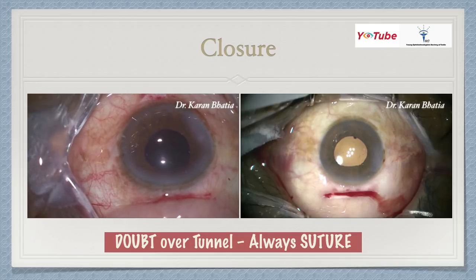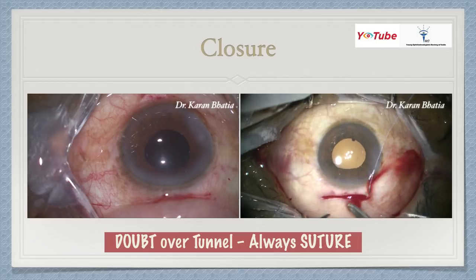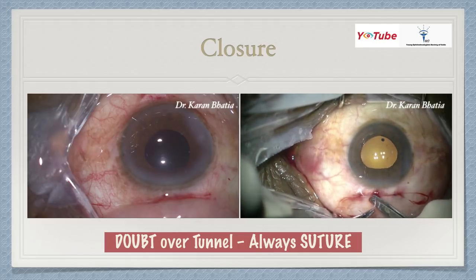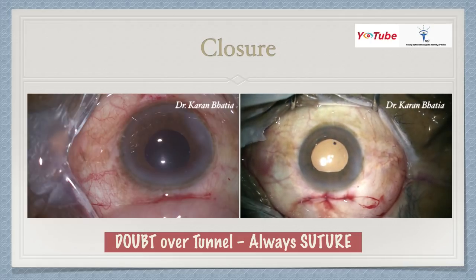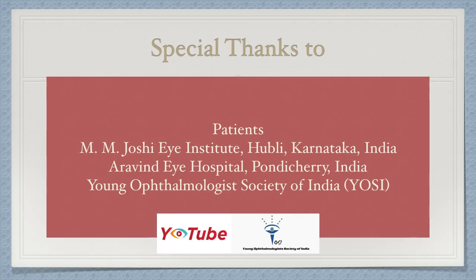To close the tunnel, after hydrating everything and closing the wounds, you can give a subconjunctival injection, cauterize the remaining conjunctiva, or suture it. When in doubt about the tunnel, always suture — even the slightest doubt warrants a suture. It is always better to handle everything at the same sitting on the operating table rather than sending the patient for another surgery. My message to juniors: never try to do fast surgery — speed will come automatically once you've mastered the art. Start with simple cases and concentrate on quality over quantity.